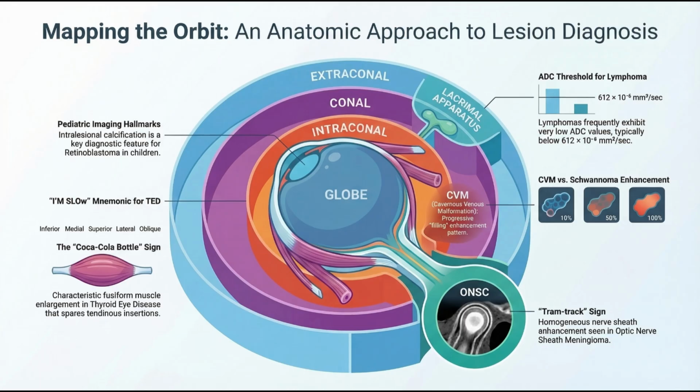On the MRI, that lack of movement is called restricted diffusion. It's a massive red flag, a hallmark of dense malignancy, which easily differentiates it from the benign, watery, free-flowing environment of a hemangioma. Wow, that ballroom visual makes it so clear. It's all about how the tissue physically handles water and blood.